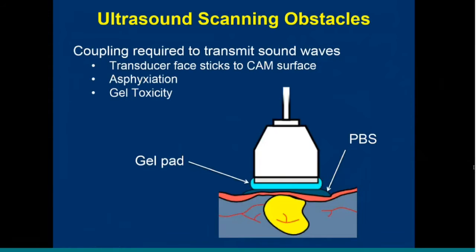And for that, of course, we rely on ultrasound. And this is a very ultrasound-centric group, so I'm not going to preach to the choir here. Suffice to say that of the modalities that we've tested, ultrasound is really the modality you want to be using here. Nothing has really come close to being able to get the images that we can with ultrasound.